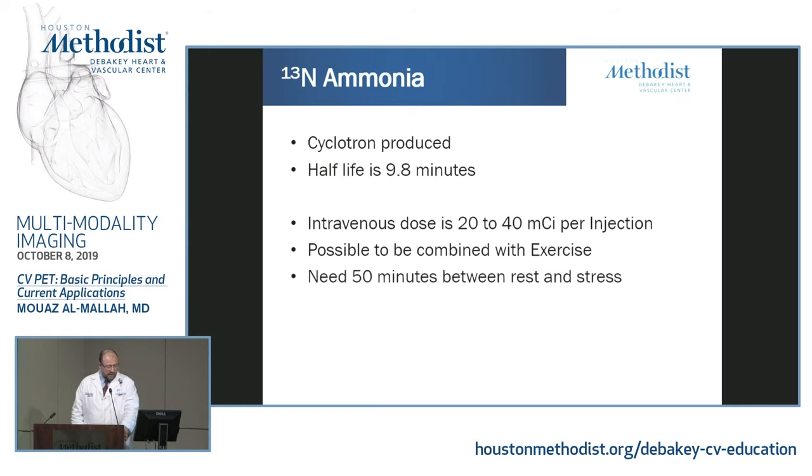Now, that's the other issue with ammonia. Because of the half-life, you do rest, but then you need to wait for the rest dose to decay, and then you inject stress. Otherwise, you have to give the fudge factor like we do in SPECT. So that's why we have to wait for 50 minutes. So technically, you put the patient on the table, then remove the patient from the table, then put them back on the table.